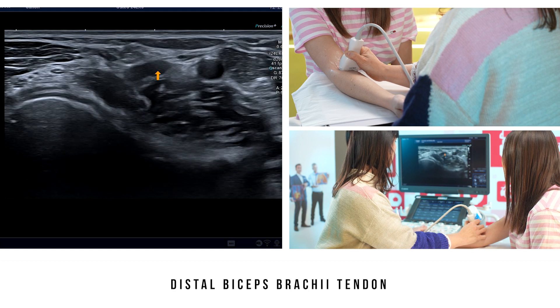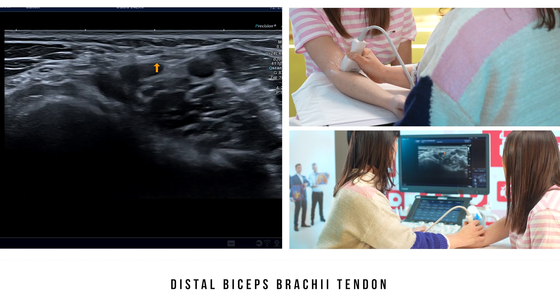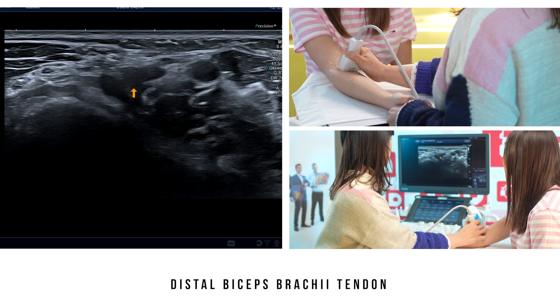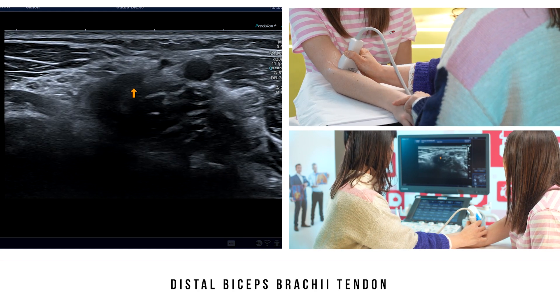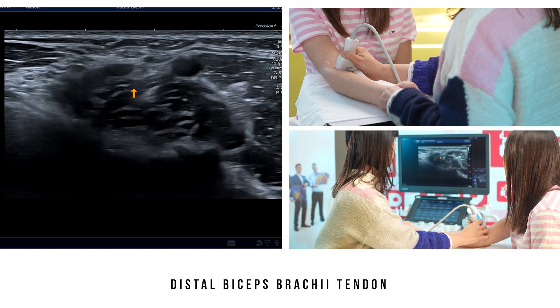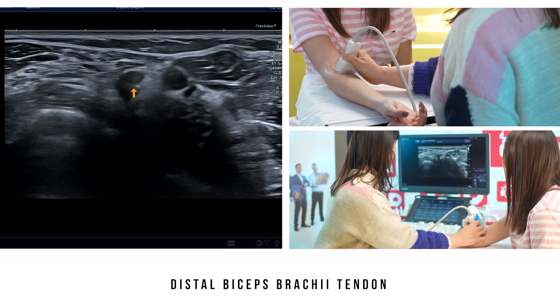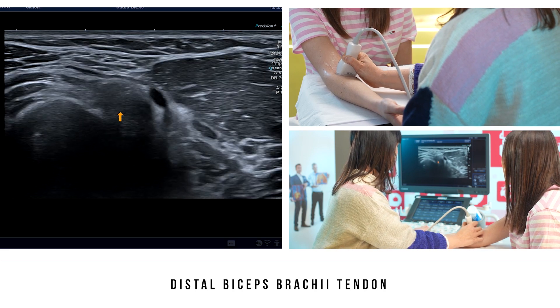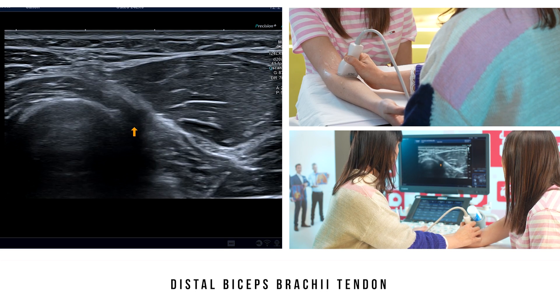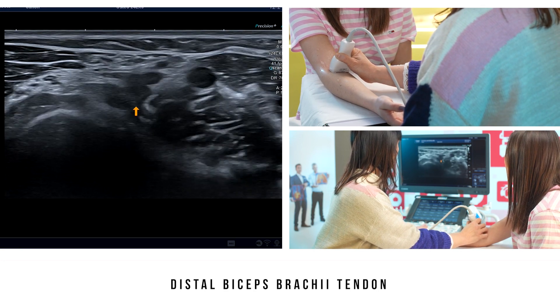If we then slide the probe down, we can see that these two tendons have switched positions — the short head of biceps is now superficial and the long head is deeper. By asking the patient to do pronation-supination movements, we can see that the two tendons pull away during supination and come closer to the neurovascular bundle in pronation. If any of these tendons are ruptured, these movements will disappear. We can continue our analysis until we reach the distal insertion at the radial tuberosity, where the larger and more distal fibres of the short head of biceps insert.